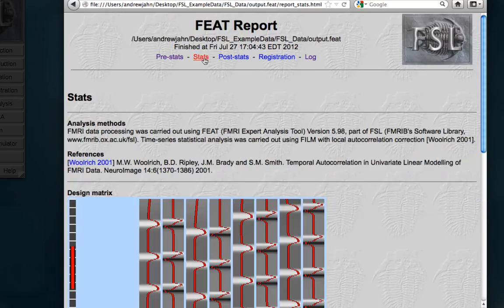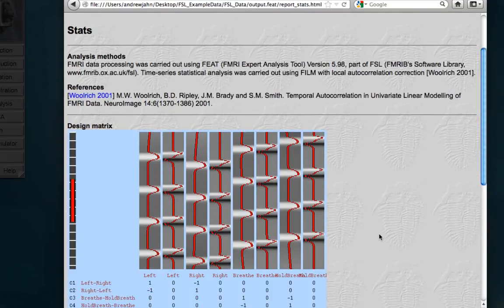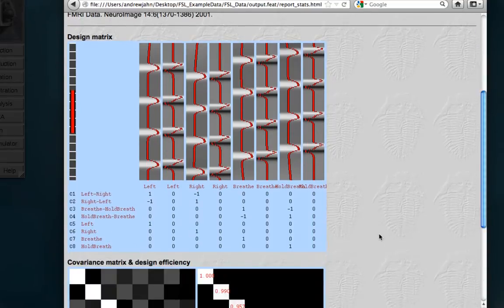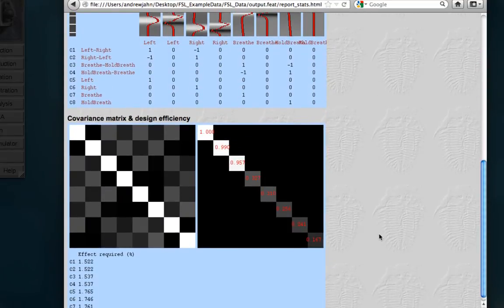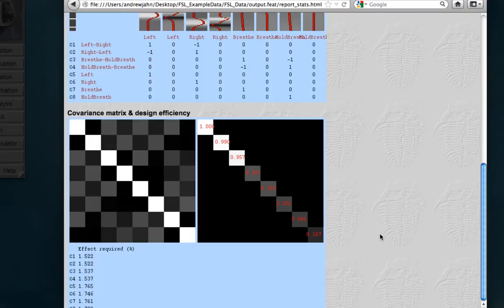Next is Stats, which is just what we looked at a couple tutorials ago. It'll show you your design matrix, and also your efficiency and the effect size needed to estimate each of these contrasts at a given Z threshold.